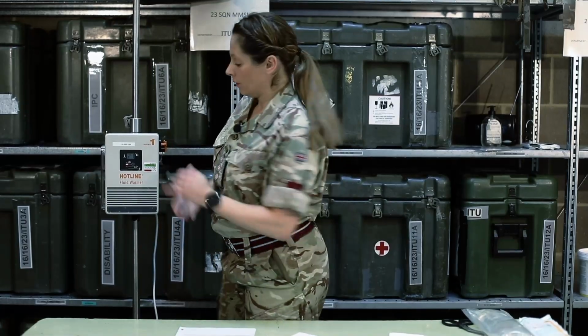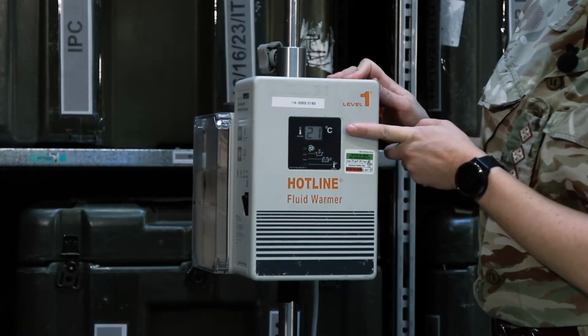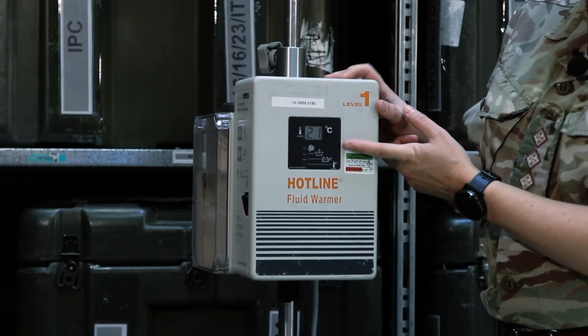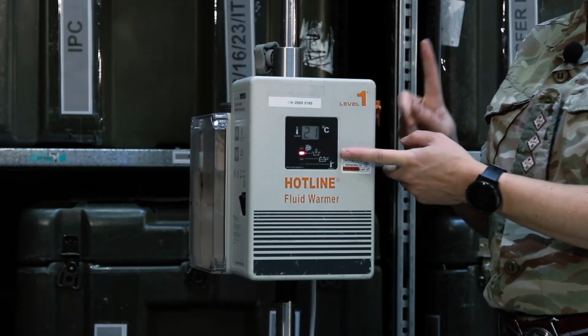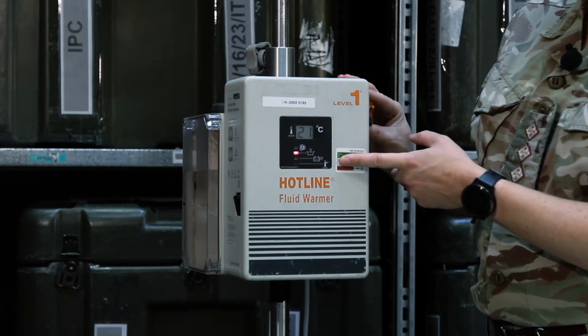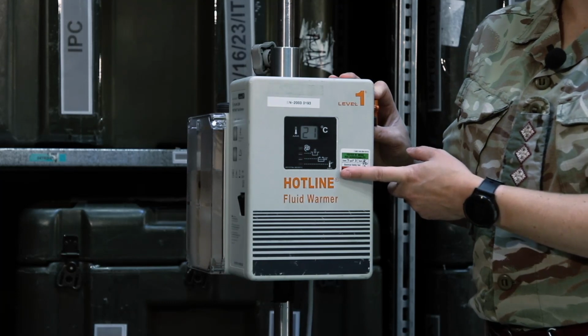Coming to the front, you've got four LED lights and the thermometer gauge up at the top here. The first light is a circulating fluid light. The second denotes an issue with the giving set, with the priming set. The third is too low water, and the bottom one is that the water is over temperature.